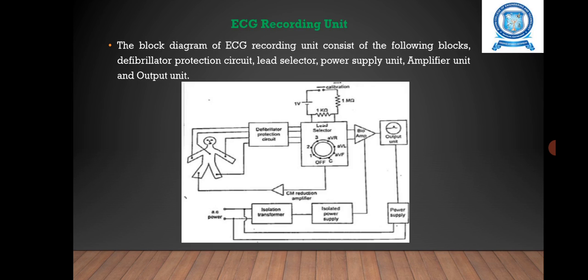In this diagram you have the bioamplifier. The bioamplifier consists of a preamplifier and the power amplifier. Using the preamplifier you can provide a switch to set the gain. It also avoids problems with small DC voltage from the polarization of the electrodes. Then the power amplifier is followed by an AC amplifier called the pen amplifier. It provides the power to drive the pen motor that records the actual ECG trace. Using the ECG recorder, you can record the output of the electrocardiograph.